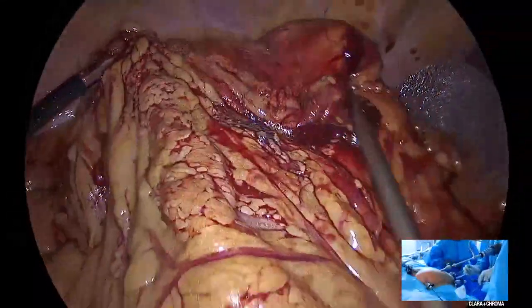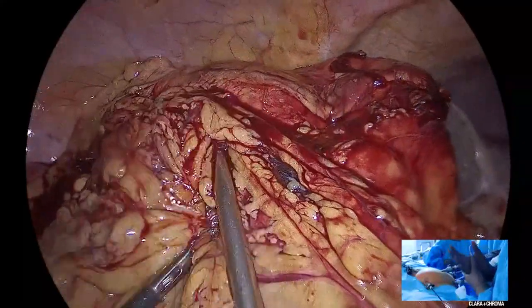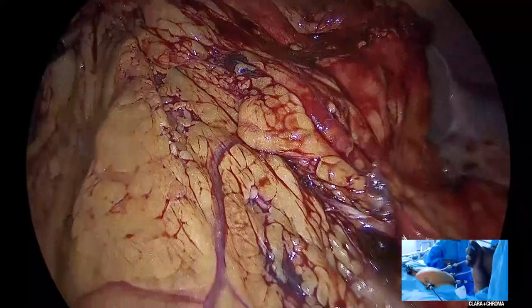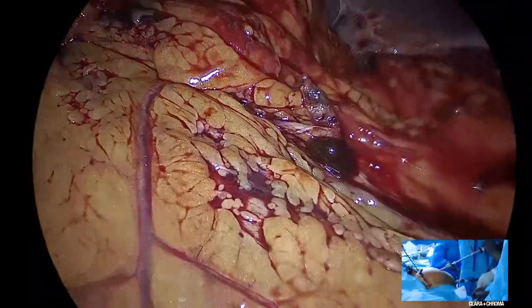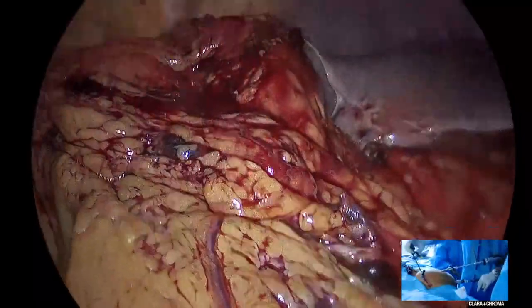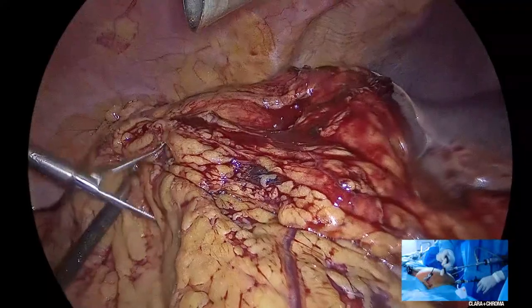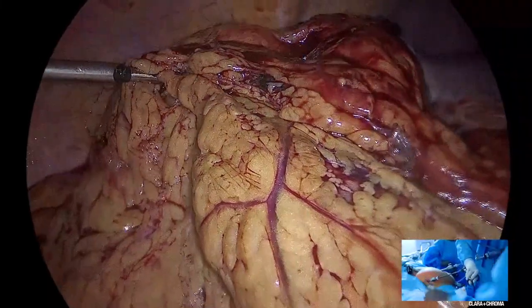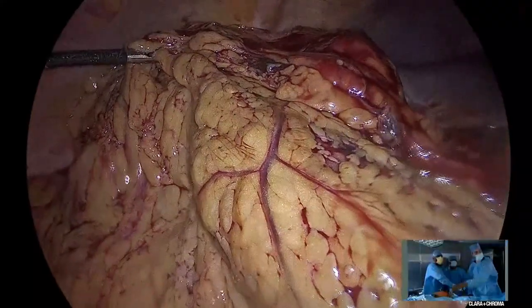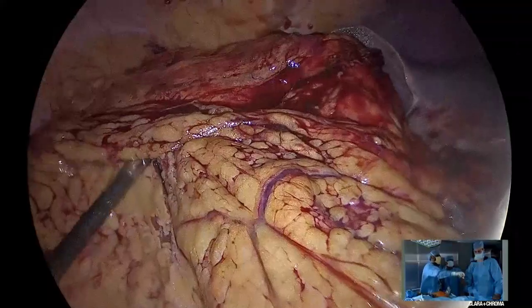Okay, so now that we've got the middle colic, we will do a bit more of this omentum. Hold this, Dora. You know, when we take the ileocolic trunk, we generally divide the ileum early in our surgery, Dr. Jameel. Yes, sir. We are discussing a variation. No, absolutely. By the time you come back, do all the dissection, you see that your ileum is very well perfused, very well vascularized.